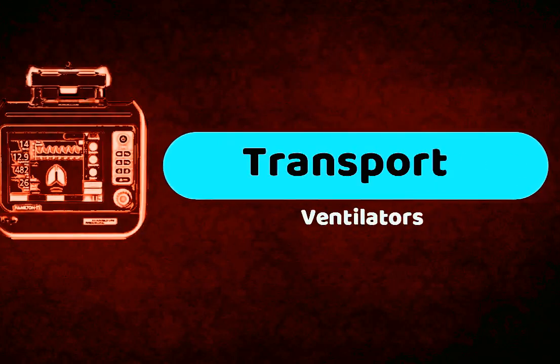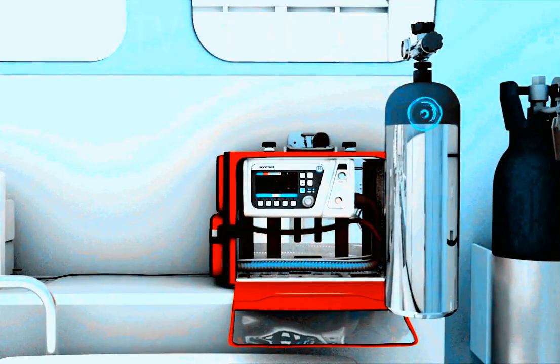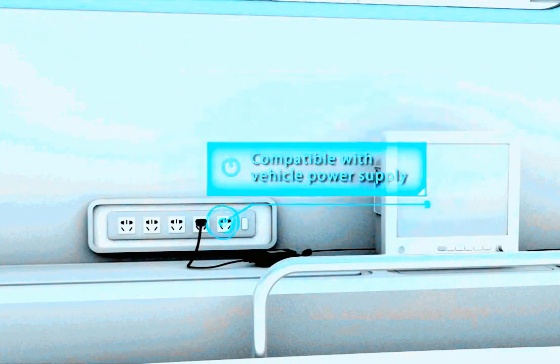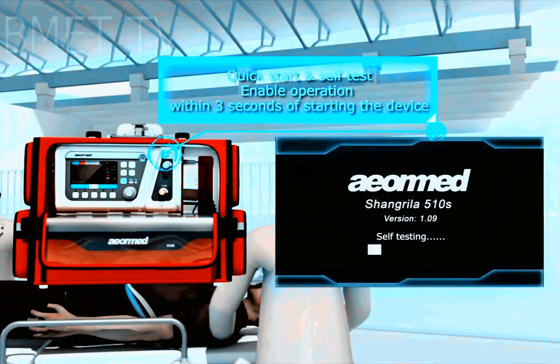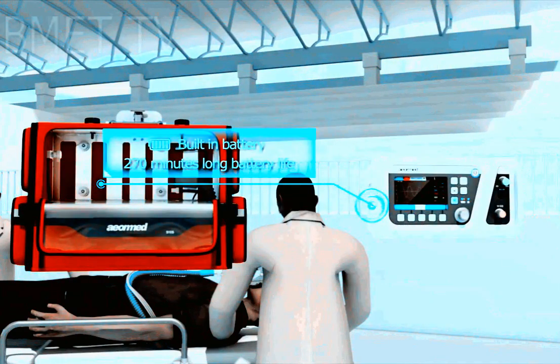Let's know about transport ventilators. Transport ventilators provide ventilatory support for patients who cannot breathe on their own or who require assistance maintaining adequate ventilation because of illness, trauma, congenital defects, or the effects of drugs like anesthetics. Transport ventilators are designed to take the place of manual ventilation or bagging during emergency or transport situations. They are designed for interhospital, intra-hospital, or pre-hospital emergency transport.